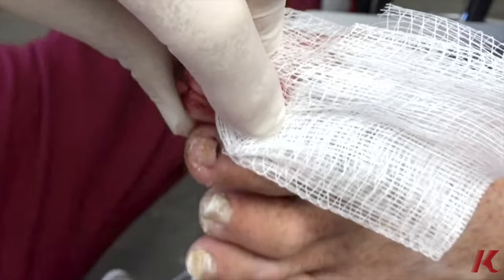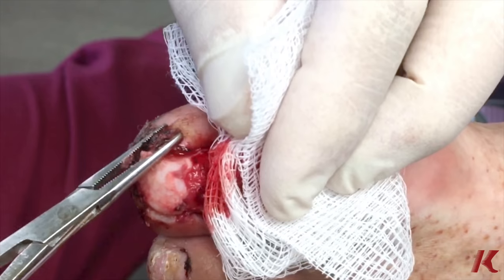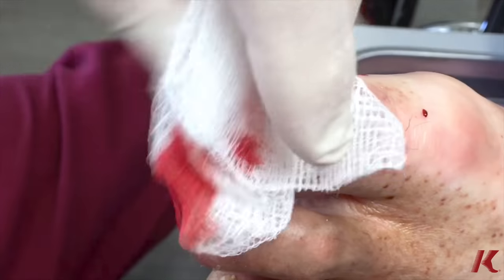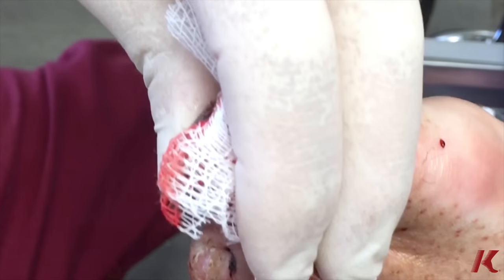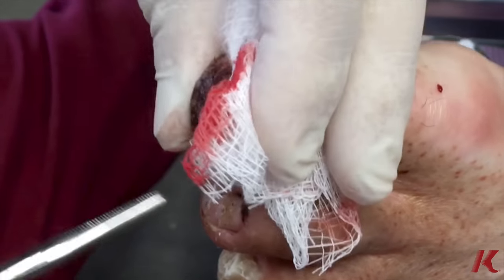Here is the toenail — took it off all in one piece. And now we're going to clean up some more of the hematoma. Hematoma is dry blood that has settled in the wound, and we just want to remove that to have a nice, healthy, fresh wound so he can heal correctly.